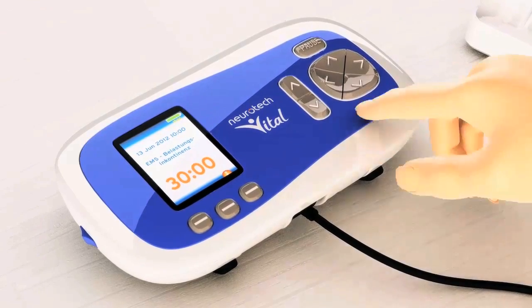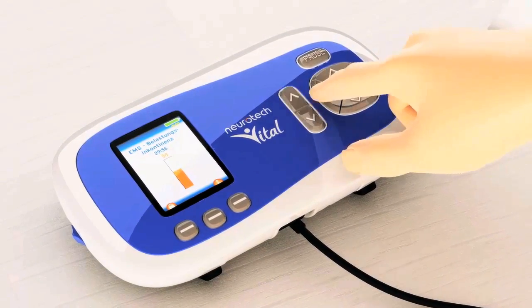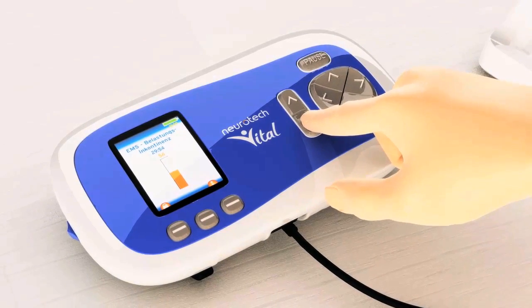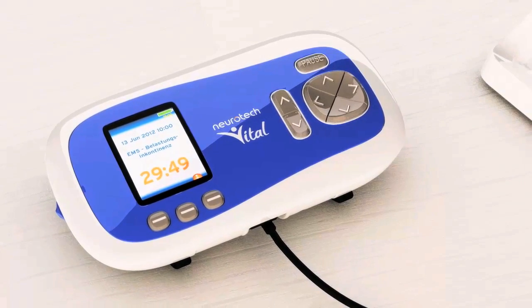You can increase and decrease the stimulation intensity by pressing the up and down arrow keys. Increase the intensity until you feel a strong but comfortable muscle contraction. The programme starts automatically.